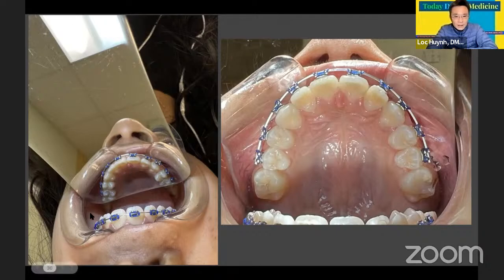And this is how you get it. You get too much stuff here. You get the face, the skin, and everything. And the nose. We don't need any of these. We need an occlusal view, just like this. So when you take a photo, make sure you put the mirror all the way inside and don't have the fogging like this that occurs.